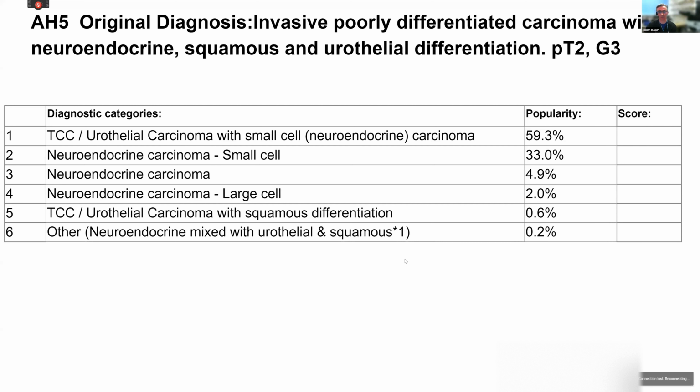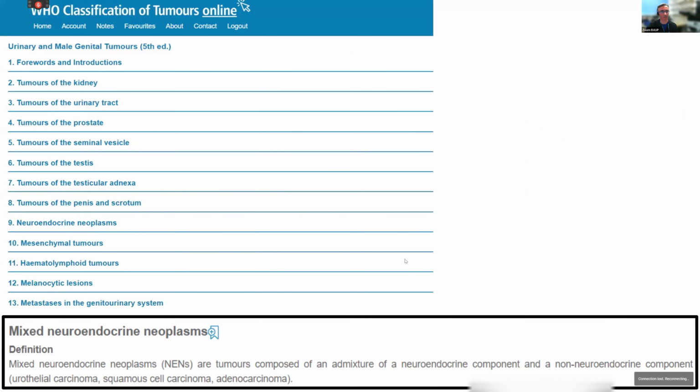Right. Okay, let's see. Just a comment here that neither CD56 nor synaptophysin are totally diagnostic of neuroendocrine origin. INSM1 and chromogranin are more specific. CD56 should not be used anymore for this purpose. Fair enough. It did look like neuroendocrine morphology, to be fair, and I think a lot of people would have called it without doing the immuno, but it does look as if it's quite a nice differentiation anyway.